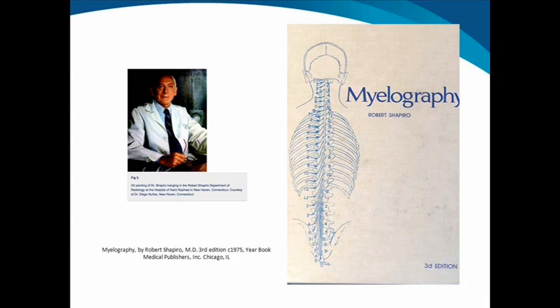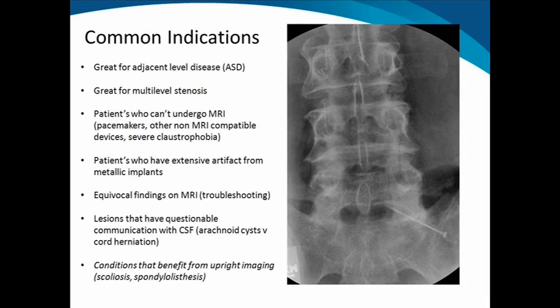This book entitled Myelography had its third edition published in 1975. Not many books since then have had this title. What are some of the common indications for a lumbar myelogram?